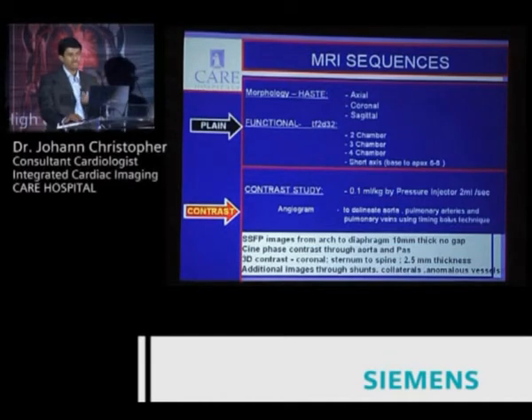So we need to image them separately, both by the functional imaging and by the cine phase contrast imaging, to get the actual flow. And we also have children who come in with BT shunts, which are possibly getting thrombosed clinically, and then we need to evaluate that shunt. So these are some of the extra things that we need to do. And this is very, very important, that we have a preoperative diagnosis before you take a patient for an MR scanner. We just don't take a fresh sort of infant in just to look for a diagnosis. Most of our infants have an X-ray, ECG, 2D echo done by the pediatric cardiology team, and we have a discussion about what extra they want from the MR, or what additional information they want, or what is something they have not really seen and they feel that's a problem.